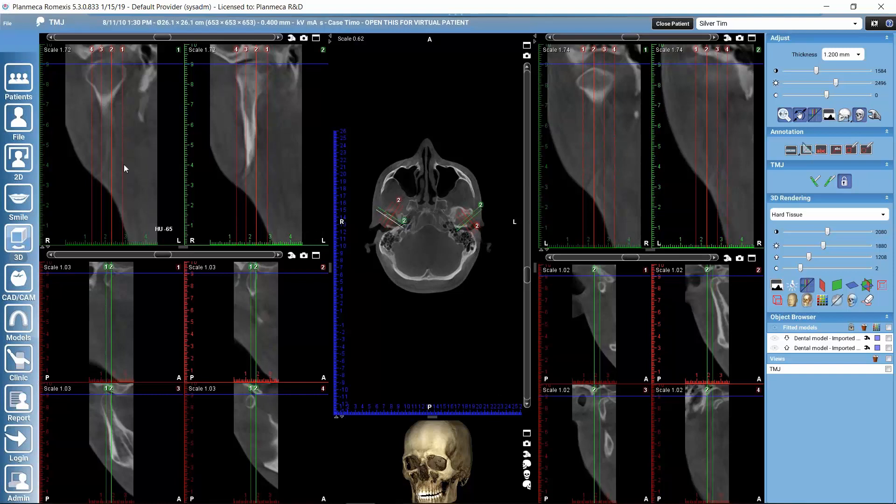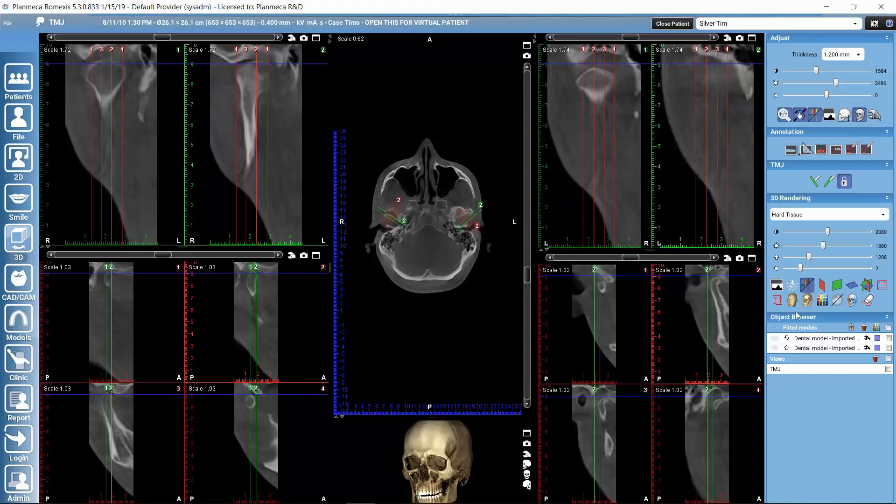And then once when we have found here the anatomy that we are interested in, and if we would like to make some measurements, naturally we have our measurement tools here. We could just activate here, for example, the measure length. Then we could just drag our measurement or we could make annotations here.